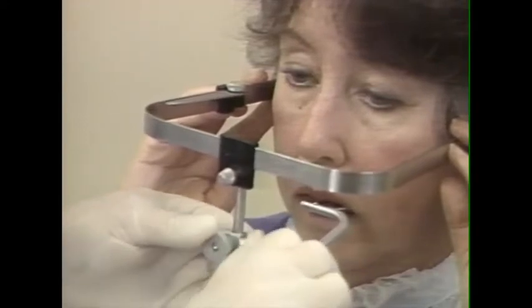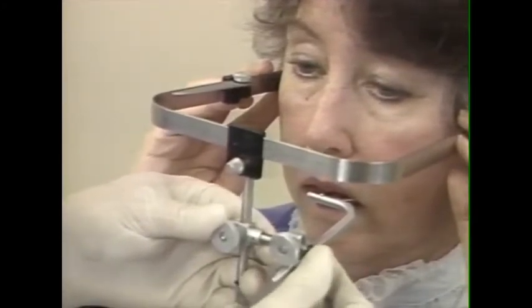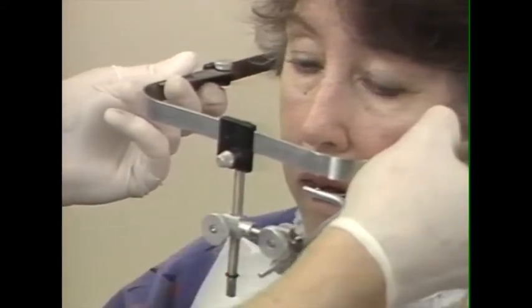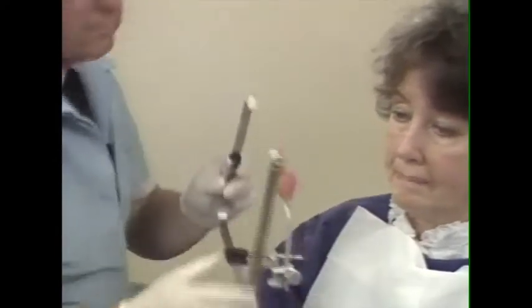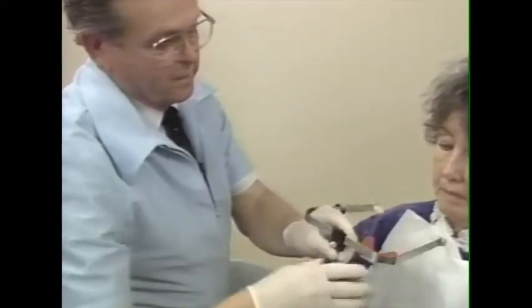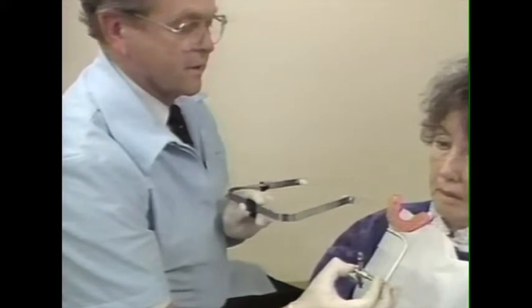We now tighten number 2 and then tighten number 3. Tighten them securely so that it won't slip. We're now ready to remove the face bow from the patient. We open, please, and slide it out of the mouth. And that completes our face bow record. We can now remove the record from the face bow, and this is what we use to transfer the cast to the articulator.